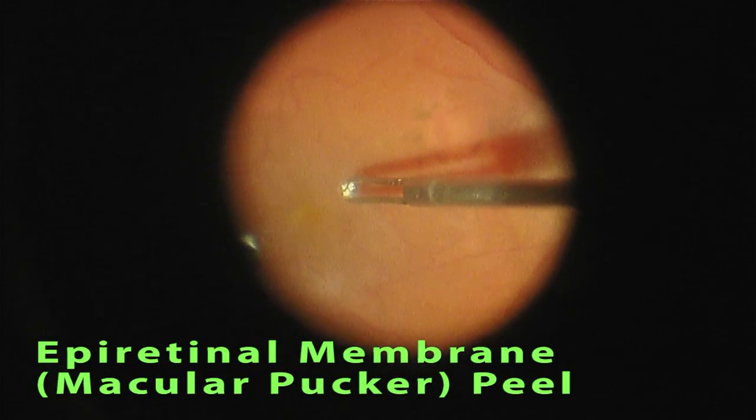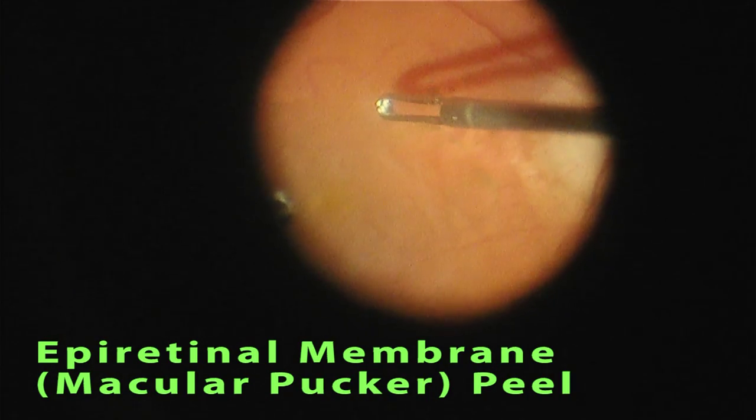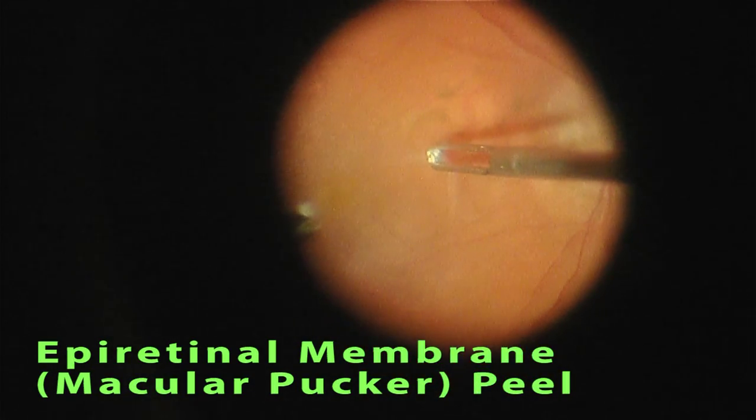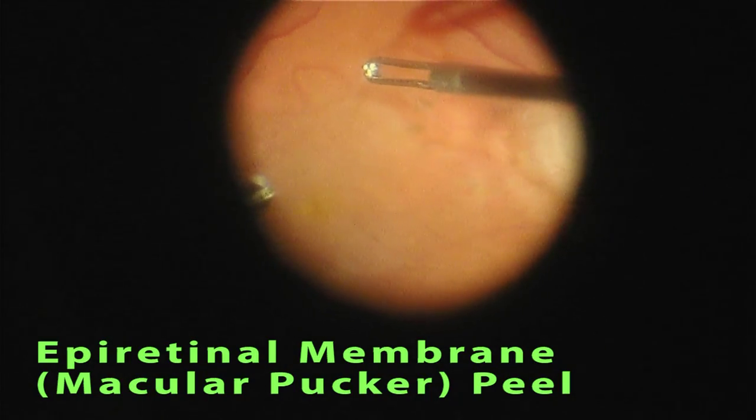Here a 25 gauge forceps has been introduced into the eye and the epiretinal membrane is grasped using the forceps and gently peeled off the macula. Peeling a macular pucker off of the retina is not unlike removing a piece of scotch tape from a piece of paper or from a piece of glass.